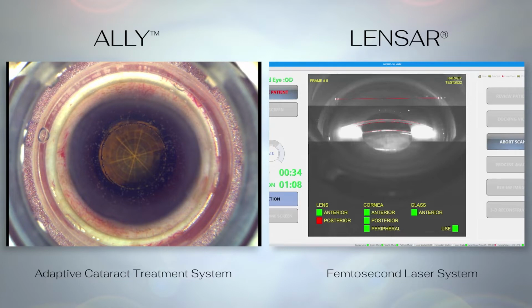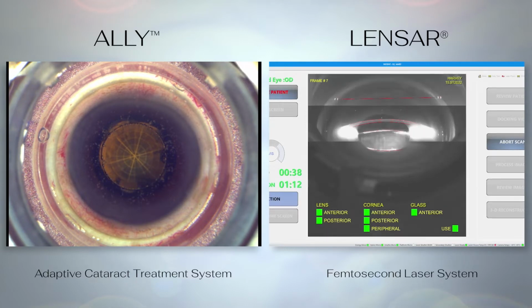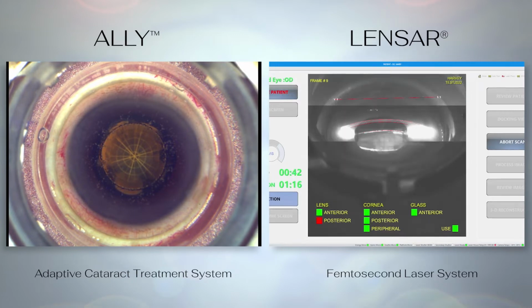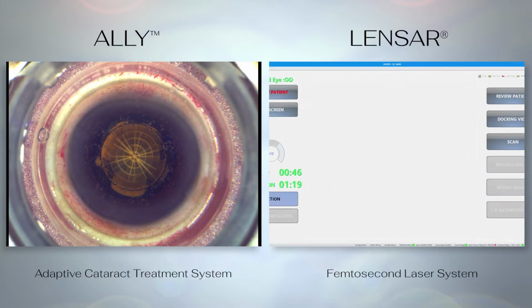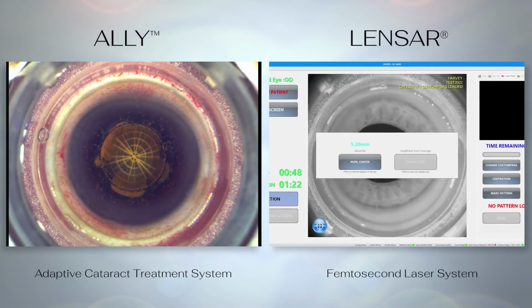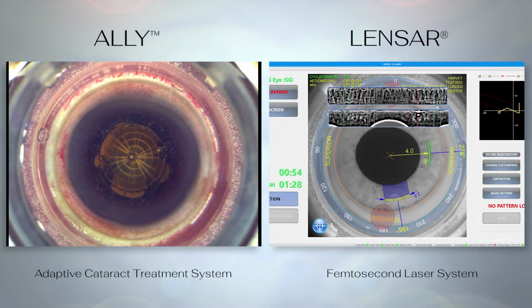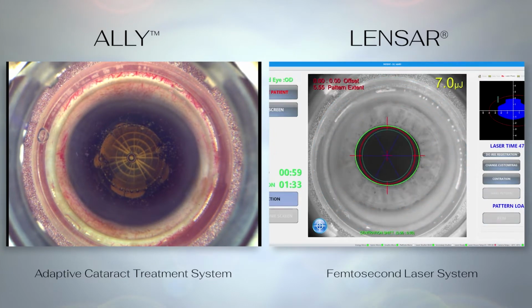In the Philippines, we have some of the hardest cataracts imaginable, and we tend to use this pie cut pattern fragmentation. But we've also tried to use other patterns like the cube pattern, and we found that all of them are very useful in the later nuclear disassembly. We also find that this color image, the down the pipe color image, is very nice because it allows the surgeon to better monitor the progress of the surgery.